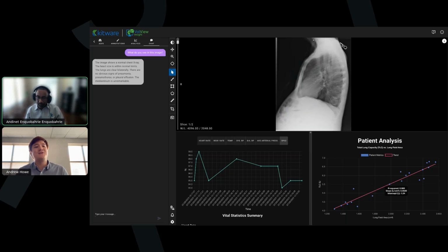Yeah. So in this case, we're using MIMIC, which is pretty much an open standard for EHR data. The MIMIC data set was compiled by, I think, some researcher at Harvard, who took a bunch of imaging data from a hospital system, as well as all their EHR records.